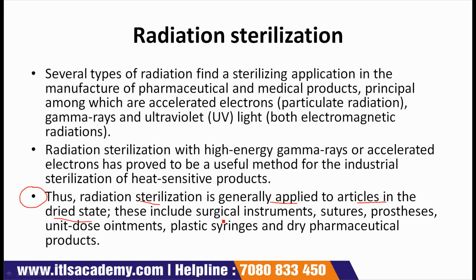These include surgical instruments, sutures, prostheses, unit dose ointments, plastic syringes, and dry pharmaceutical products. Ultraviolet light, with its much lower energy, causes less damage to microbial DNA.